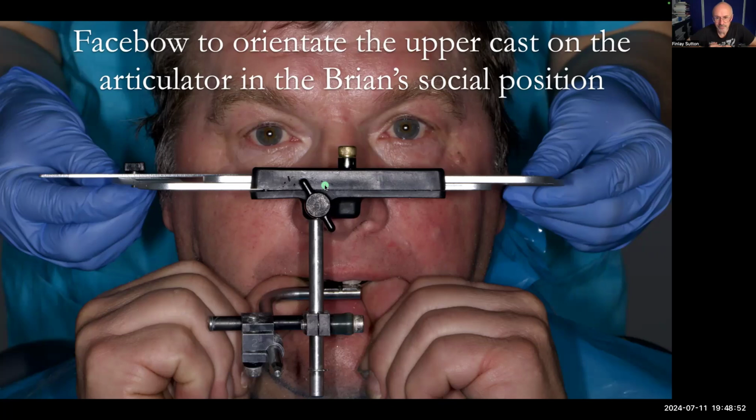There's a lot of negative papers about the uses of face bows at the moment, and people saying that we really don't need them at all. But I really find it extremely useful for Rowan to have the patient's head looking at him straight on the bench, because if I don't use a face bow and it's not mounted using that plane, Rowan could have the patient's head tilted on the bench like that. And it's much harder for a technician to arrange the teeth like this.